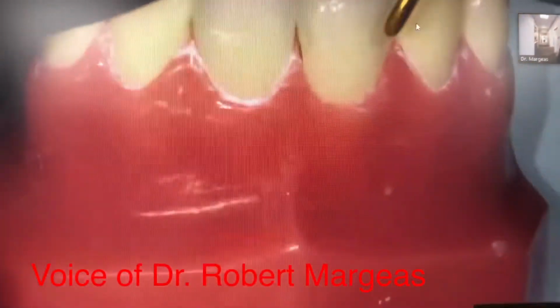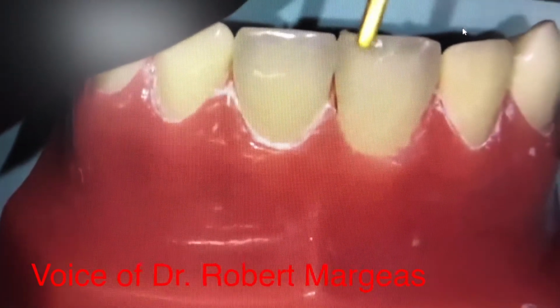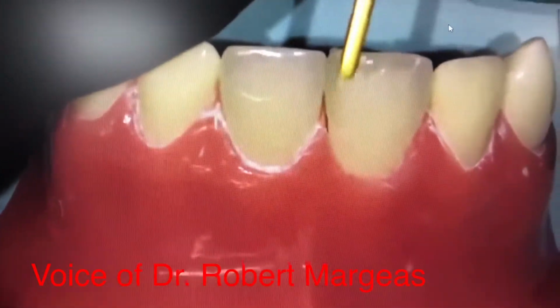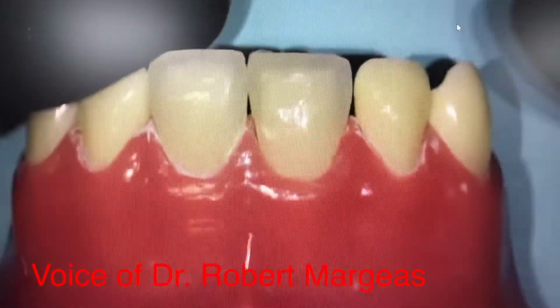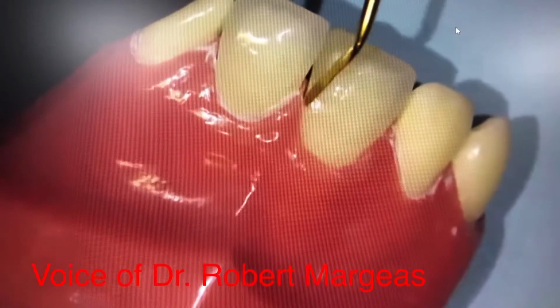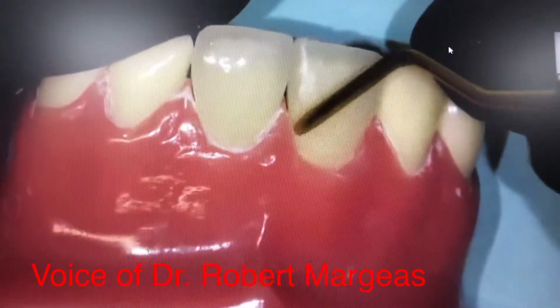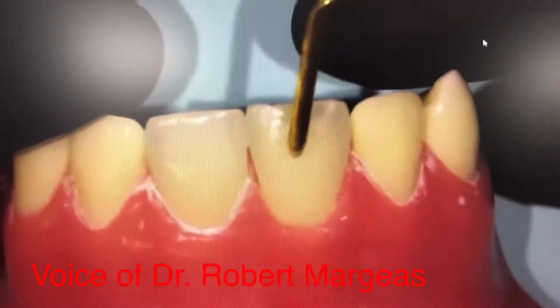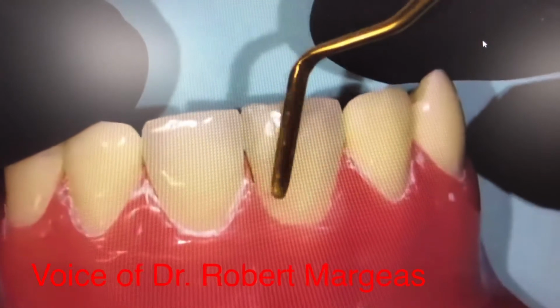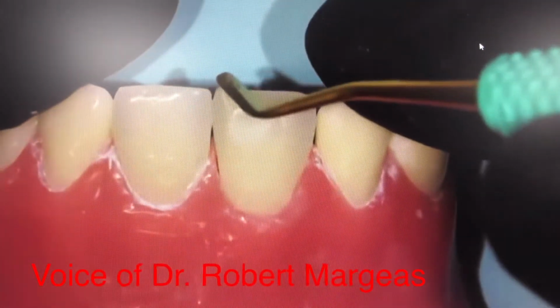Now, I want to take my instrument again and blend this in, because I don't want this too thick, because I still need room to put my enamel. But you see I have room still. I built that in. All that here is doing is occupying the space that was kept off of where the dentin was placed. And when I light cure this, I want you to pay attention to how it will form and show you the translucence.